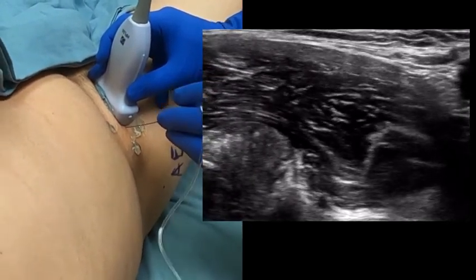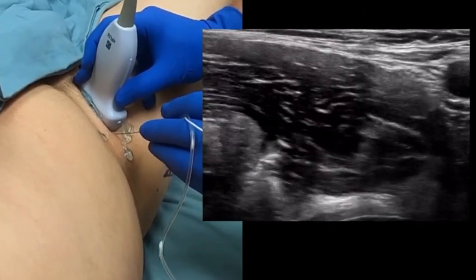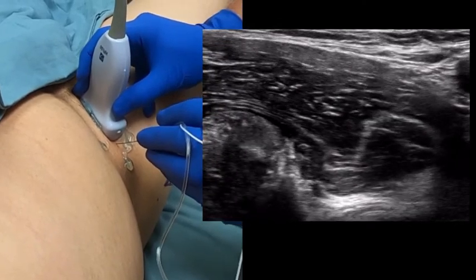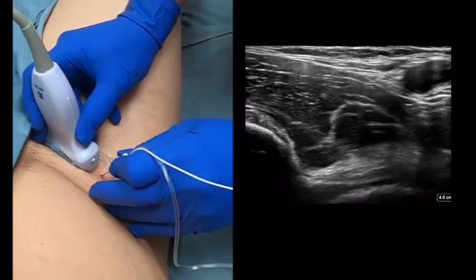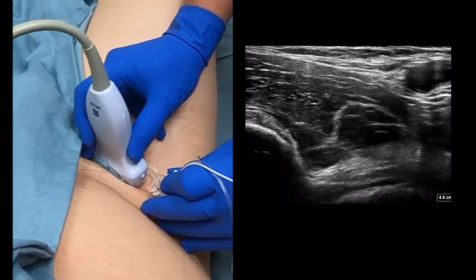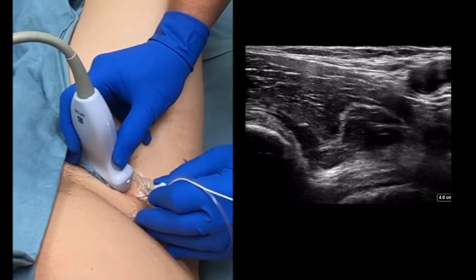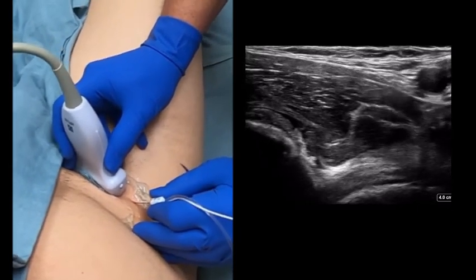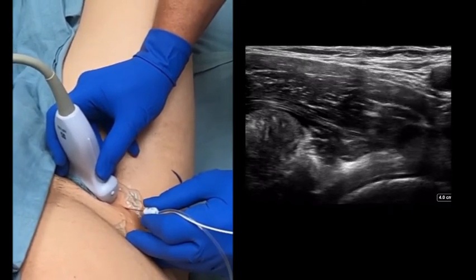Injection pressures will be higher than other peripheral nerve blocks. If you encounter difficulty on injection, it is helpful to place traction on the needle laterally. 20 mL of 0.5% ropivacaine with 4 mg decadron is used for this block. You should see the psoas tendon being lifted up during the injection. Most patients are reporting over 72 hours of pain relief using this local mixture.